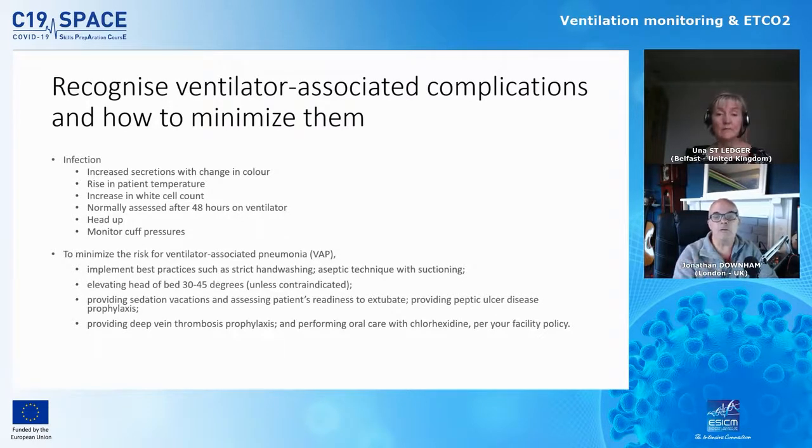And this is normally only assessed after 48 hours on a ventilator, so that we can call it a ventilator-associated pneumonia rather than perhaps a community or a hospital-acquired pneumonia. So we keep them head up and we need to monitor those cuff pressures as well, because if the cuff starts to go down, then those microfolds could become bigger, allowing those secretions to go down.